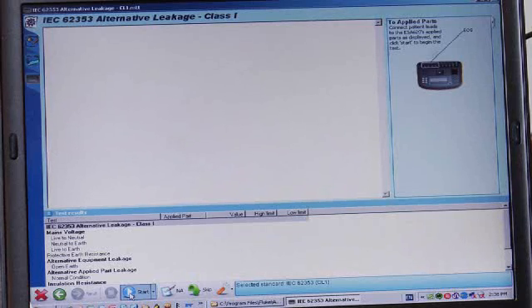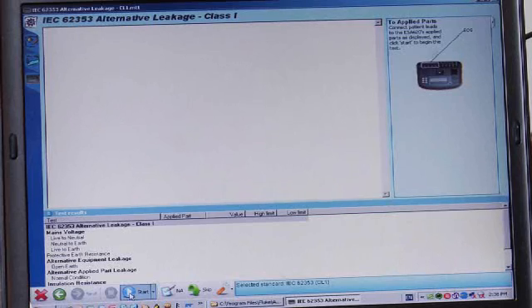Performing the electrical safety test is easy. All we need to do is click start.